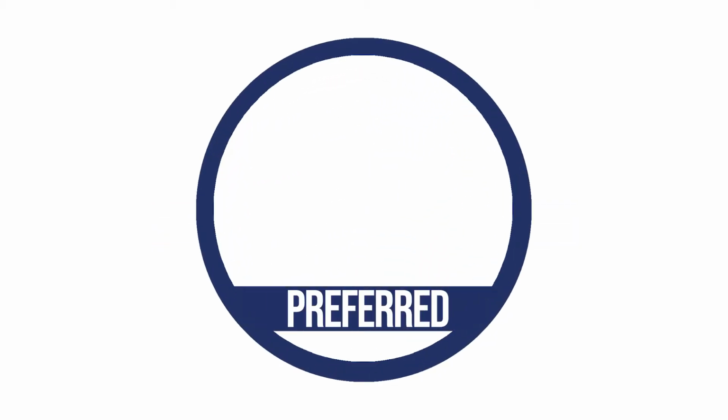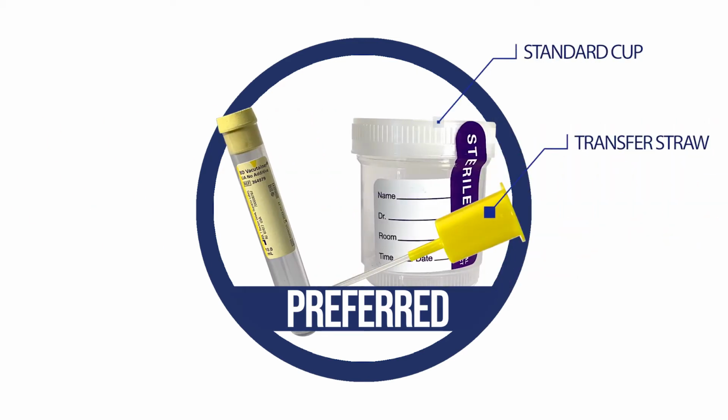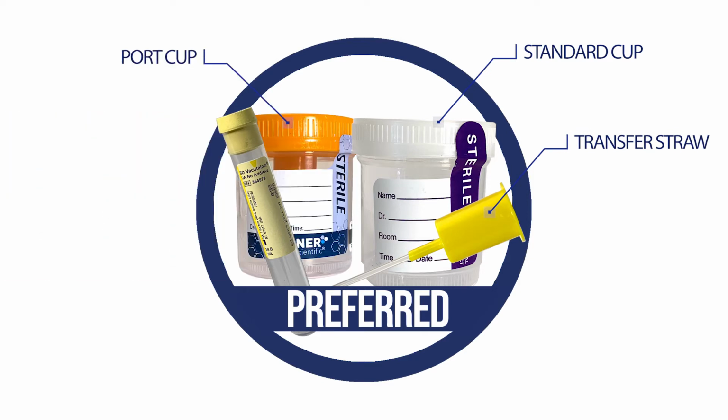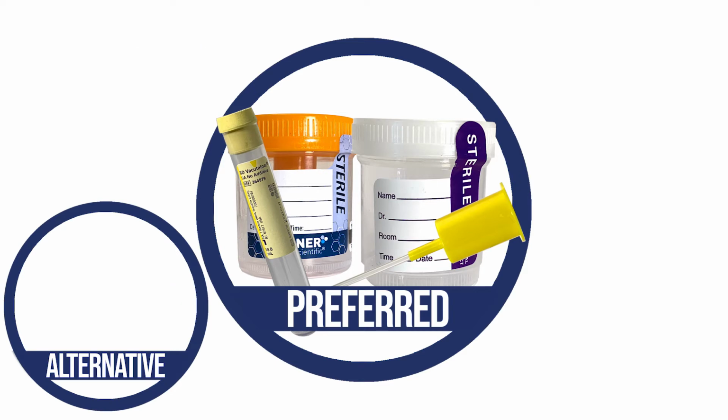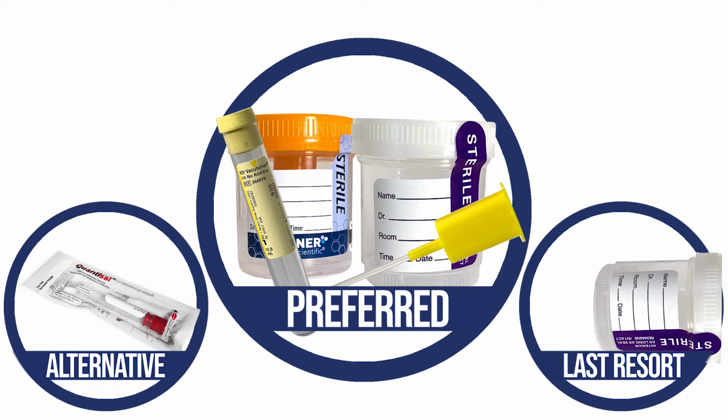The supplies you need for proper specimen collection and transport depend on how specimens will be submitted to MD Labs. The preferred method is using a vacutainer with either a standard collection cup and transfer straw or with a port cup, which has a pin built into the lid of the collection cup. An alternative method is using and submitting an oral fluid collection device sponge. As a last resort, you can submit the urine in the collection cup. However, this is not recommended, as the cups often spill during transport and create challenges for the lab.